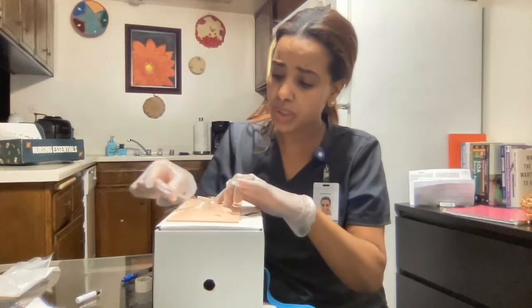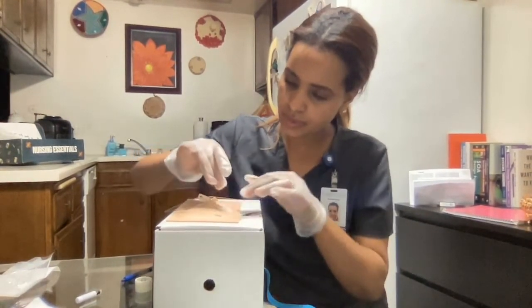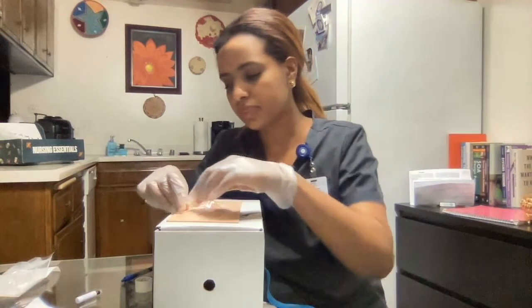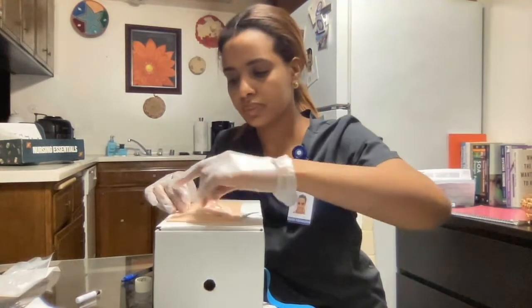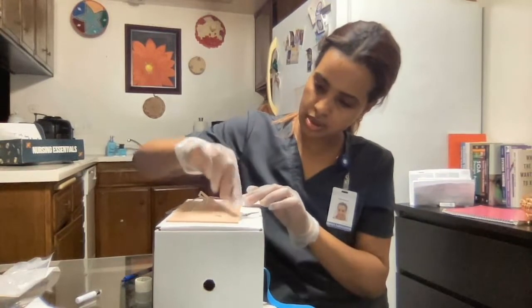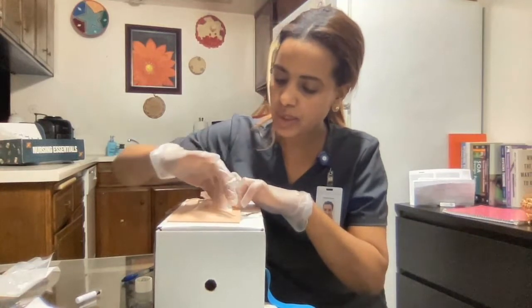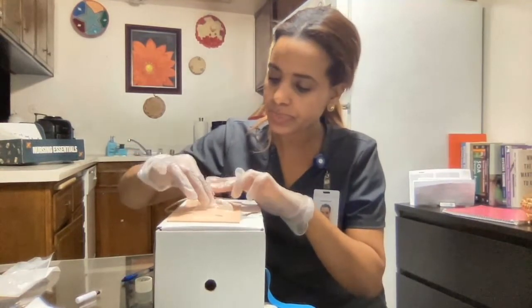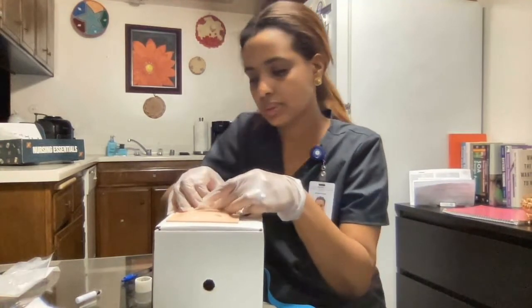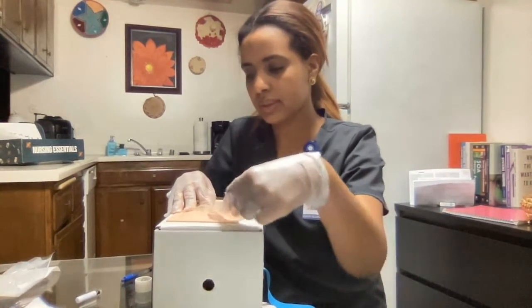After applying the dressing, I make sure it is nicely placed and not blocking anything. Now I'm going to put my initials, the date, and the gauge size on the label. Then I'll place a tape to secure the extension tubing — make sure there are no kinks and nothing is blocked. This is how we secure an inserted IV, and make sure you do not forget to clamp it.